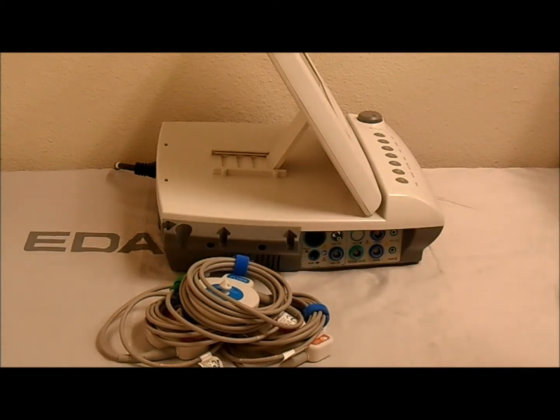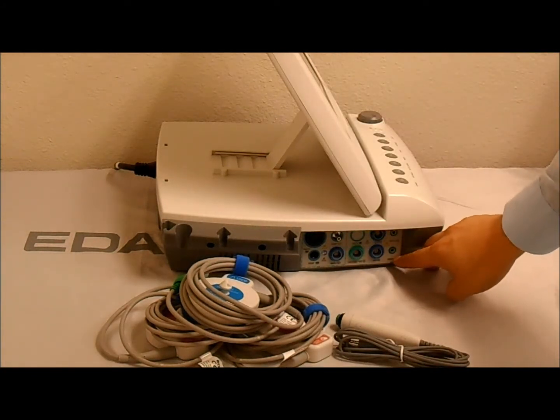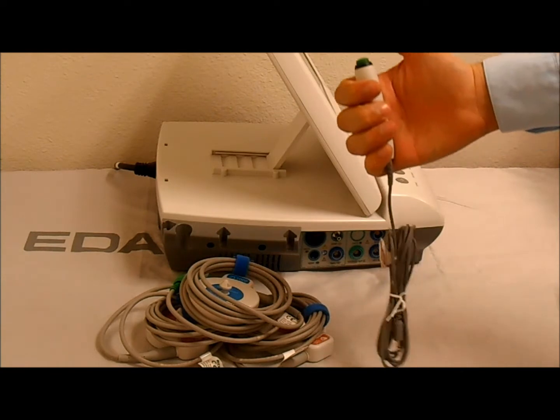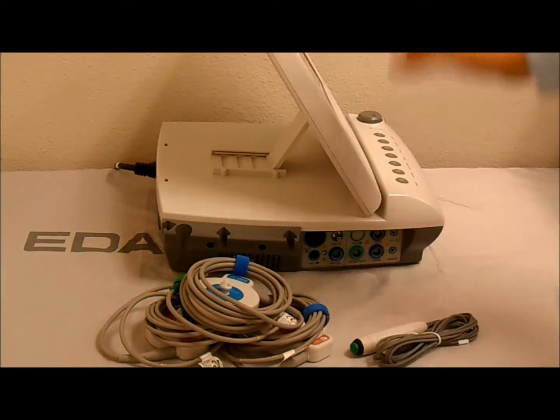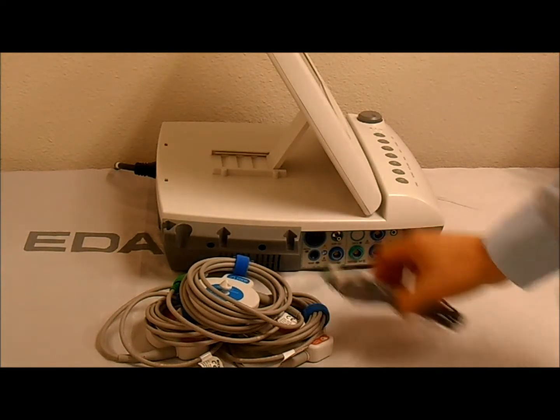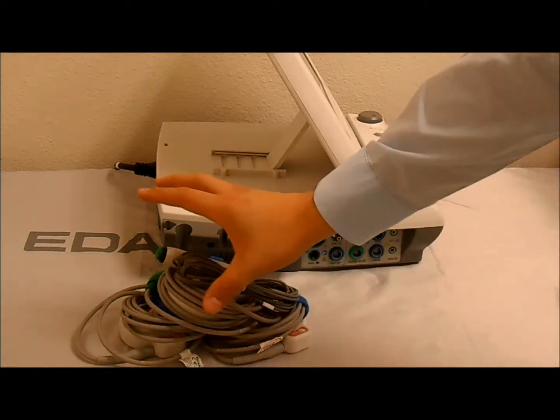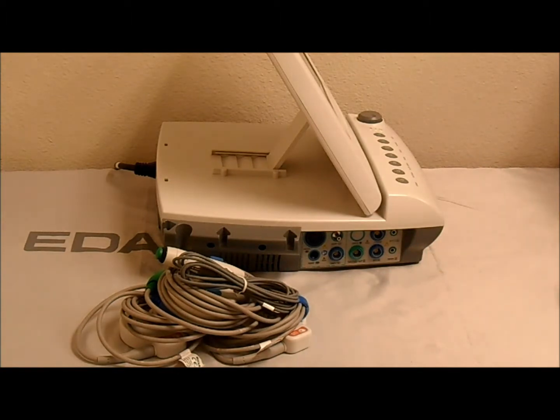And finally, we have the remote marker. This connects on the mark port, and this is what the mother would press to generate a mark on the strip of the fetal monitoring waveform to note some sort of activity or reference. So these are your fetal monitor transducers and sensors. These are used to take readings and provide readings on your CTG waveform.